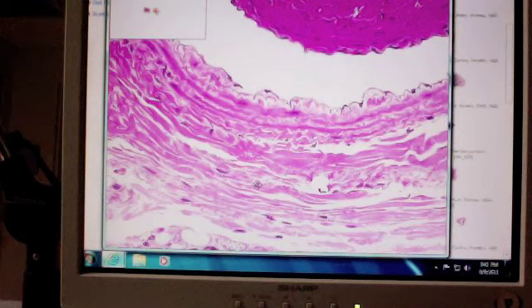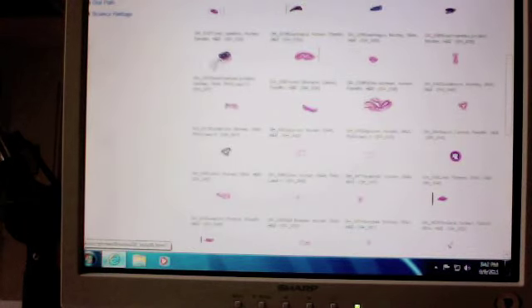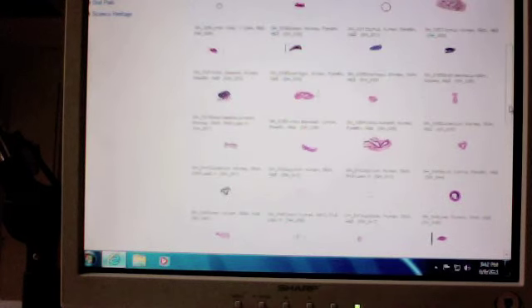Then the other kind of simple squamous epithelium that we have is the kind that doesn't line the insides of organs or vessels, it lines the outsides. And again, for the blood vessel, the other way I could word that question would be, name the epithelium lining this blood vessel. Okay? And then I would expect, obviously, endothelium.